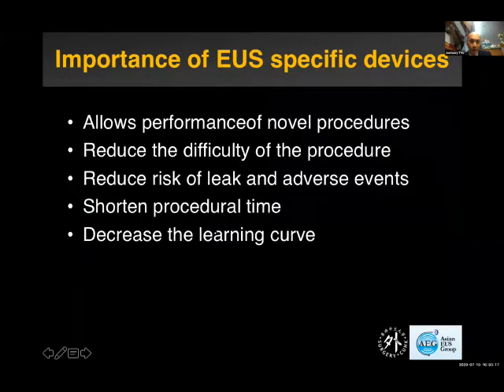The development of these EUS-specific devices is very important because it allows performance of novel procedures, reduces the difficulty of the procedure, and also reduces the risk of leak or complications. It also helps to shorten the procedural time as well as decrease the learning curve for the procedure.